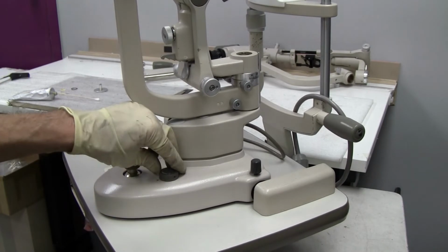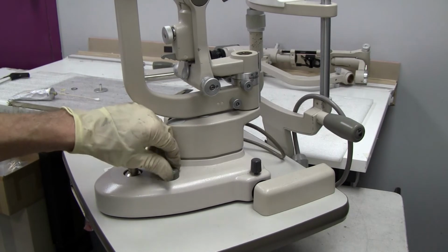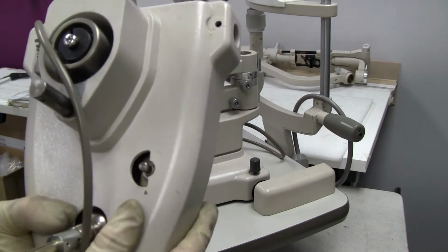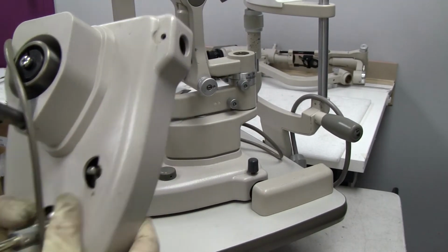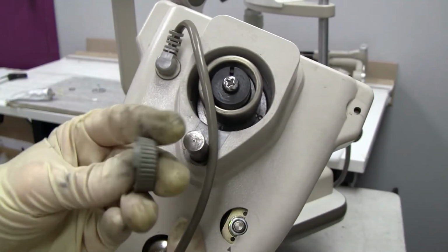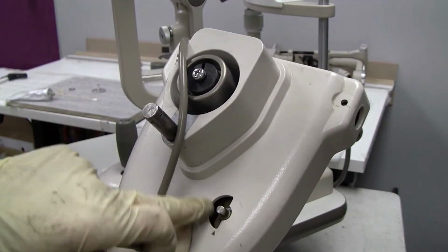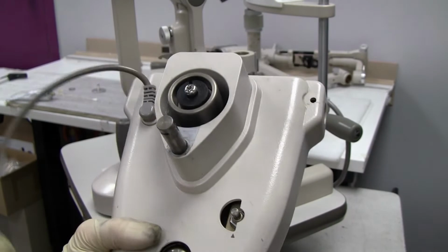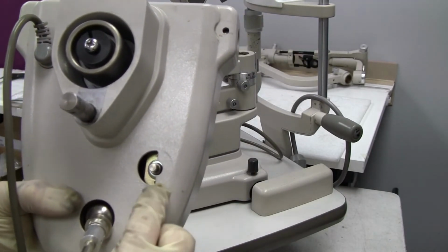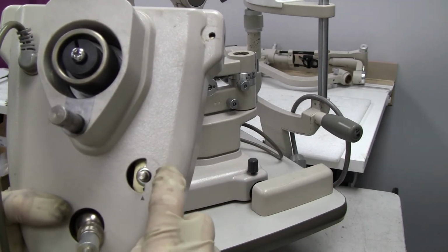This is the rheostat or potentiometer, and it only has a certain amount of travel. It only has that much travel. And this is the knob that fits into here, this little half moon. However, the rheostat has more room than just the half. It can go past it, or it can go above it.